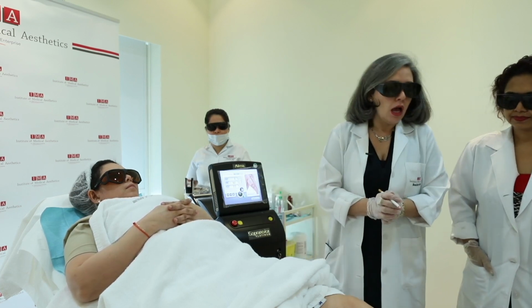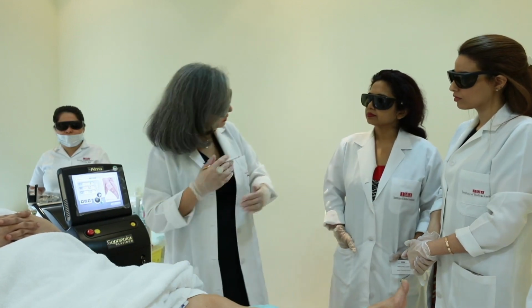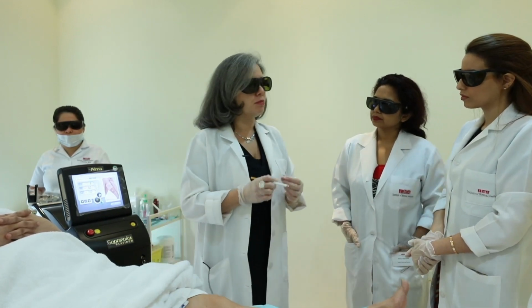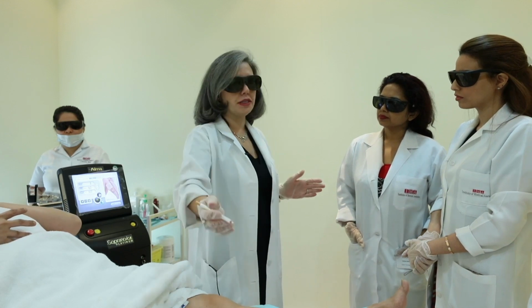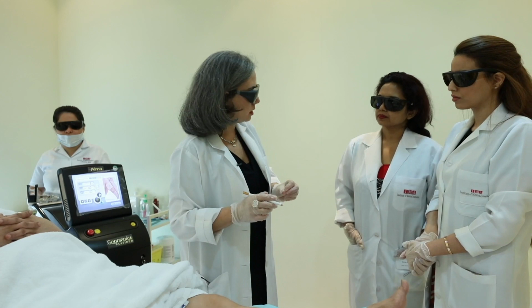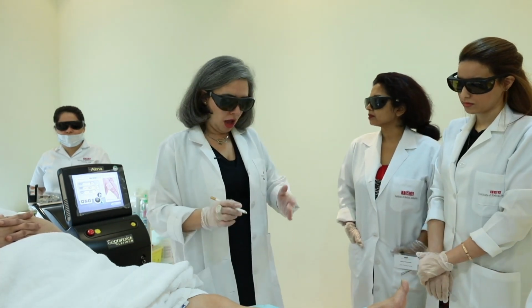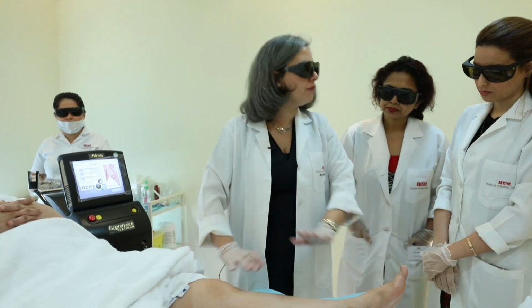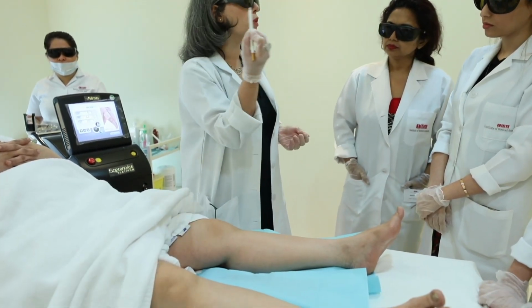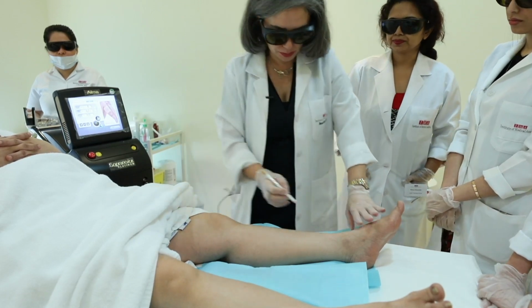Exactly. Now that we are going to use a laser, one of the latest technology that works in motion, I have to have a grid size. A grid size should be more or less precise. The grid size of this machine is 300 square centimeters. It means I have to know exactly where is the grid that I'm working. With which kind of pencil can I do the marking? White. Always white pencil.